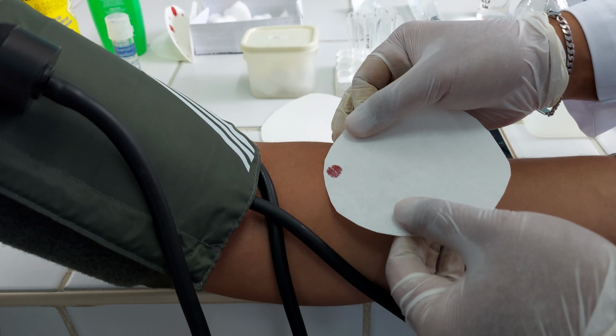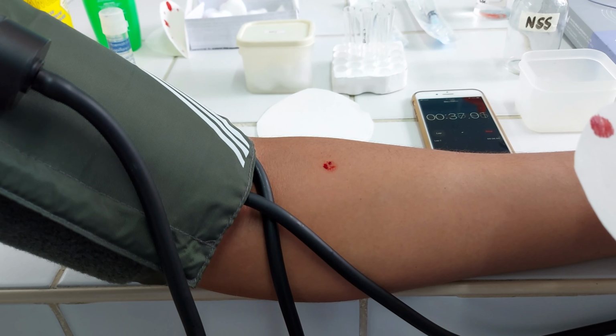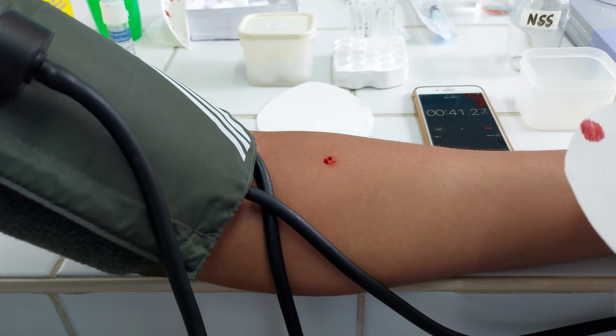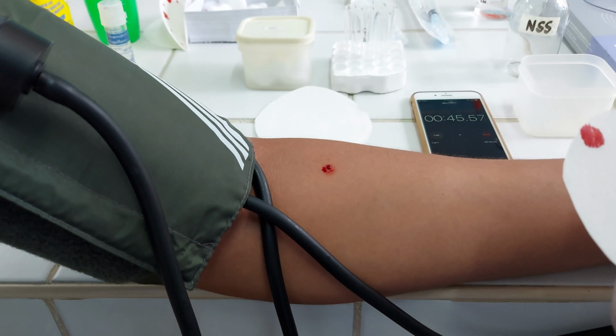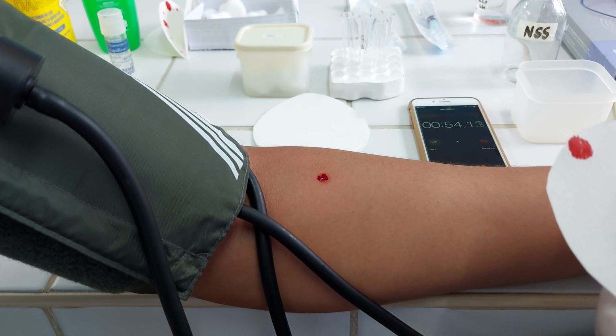After 30 seconds, same procedure, blot the blood using filter paper and blot the blood every 30 seconds until blood no longer stains the paper. Stop the timer when the bleeding stops. Bleeding time is determined to the nearest 30 seconds. If the bleeding continues after 15 minutes, terminate the procedure and apply pressure to the incision site.